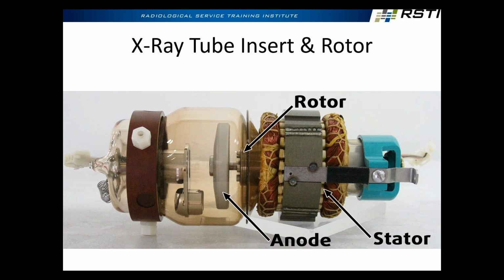And in most modern tubes, you have pins that will take a lot of the torque. You have lock washers, and they stake the threads, actually deform the threads to mechanically lock them. The chances of one of those coming off is fairly slim, but it's not 100%.